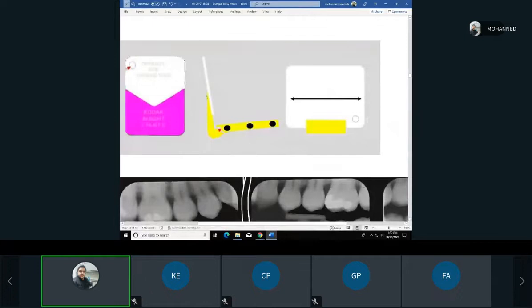So you can see here again the placement. This is something that we used to teach again. Although again, same thing when you use the ones that have the letter on them. So it'd be the dot in the slot.